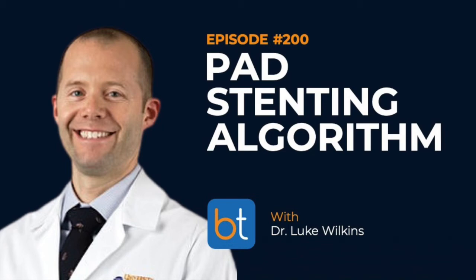So let's say you attempt true lumen, you fail. What's your next step? So then I typically go with a subintimal recan. Great. Could you tell me a little bit more about your technique for that? Sure. I would say most practitioners will start with a glide wire and angle tip catheter, either a 4 or 5 French angle tip catheter. I like to use telescoping catheters frequently. So I'll use a 018 crossing catheter telescoped inside of an 035 crossing catheter.